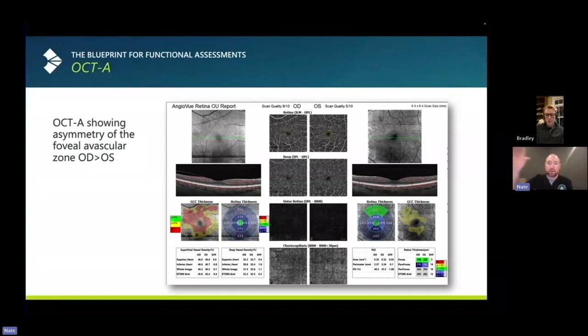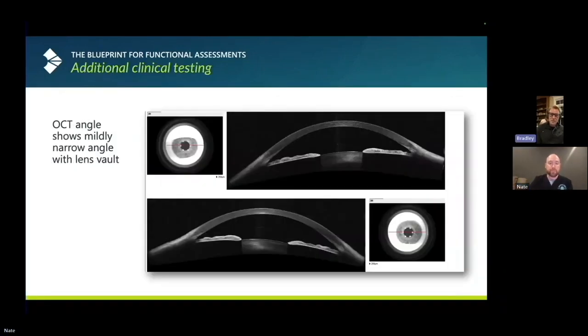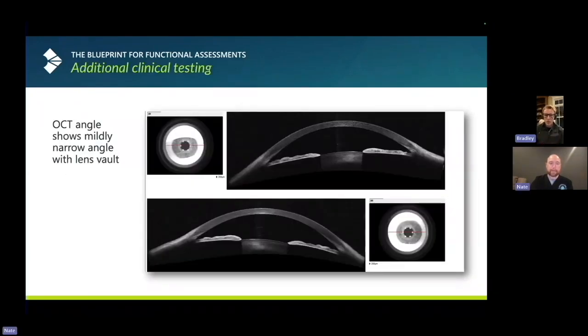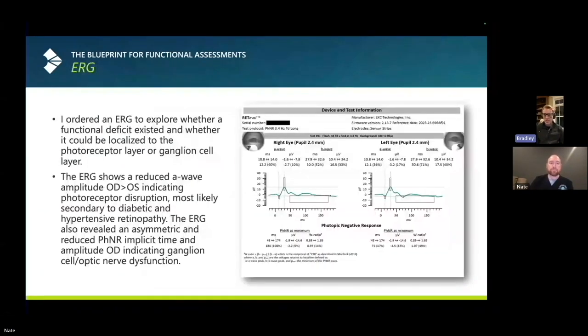We're focusing on glaucoma here, right, but go back to that diabetes and diabetic retinopathy. You now have a billable code so that you can do our diabetic retinopathy protocol as well if this patient didn't have glaucoma. Right, correct. So OCT of the angles here, a little bit narrow, nothing major. They're not closed. So we get to the ERG, and this is a different protocol than Dr. Lighthizer had been showing on the DR score. What I like about this protocol is it's a little bit more specific in terms of where that damage is maybe coming from.